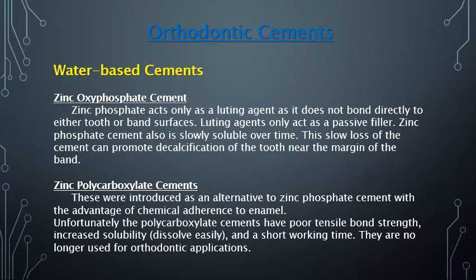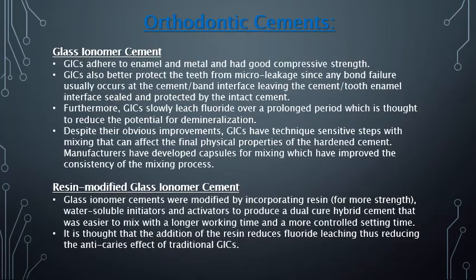Zinc polycarboxylate cements. These were introduced as an alternative to zinc phosphate cement, with the advantage of chemical adherence to the enamel. Unfortunately, the polycarboxylate cements have a poor tensile strength, increased solubility, and short working time. They are no longer used for orthodontic applications.